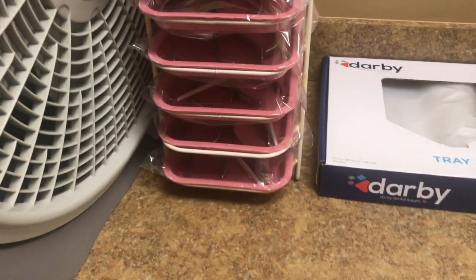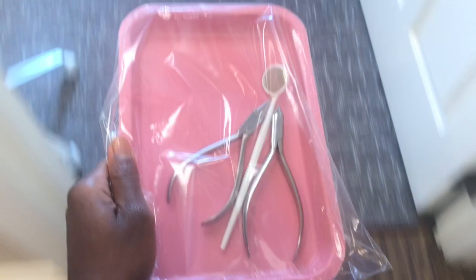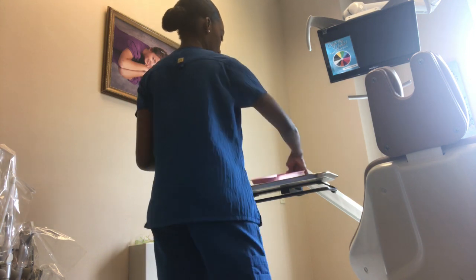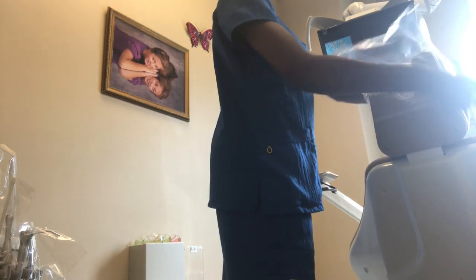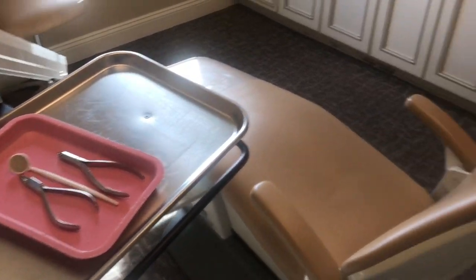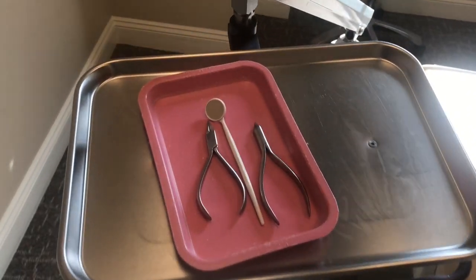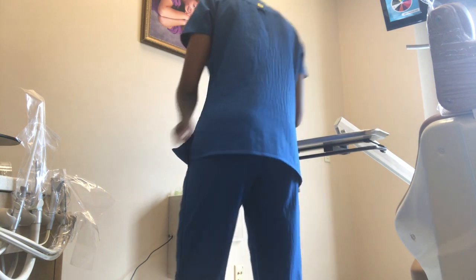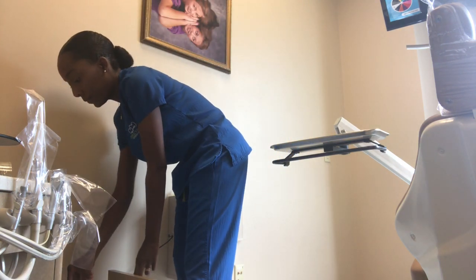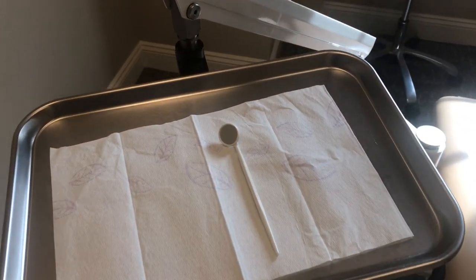For our retainer appointments I'll grab one of these retainer trays and take it to one of our stations. Here's our setup for retainer appointments. As you can see, we only have two pliers and a mouth mirror that we use for checking retainers — we use the pliers for Hawley retainers. But if you come in for a retainer check and you have a clear retainer, we will only need a mouth mirror. Here you see me just setting up for a basic retainer appointment for a person who has clear retainers.